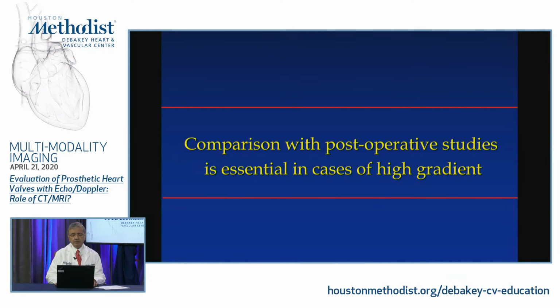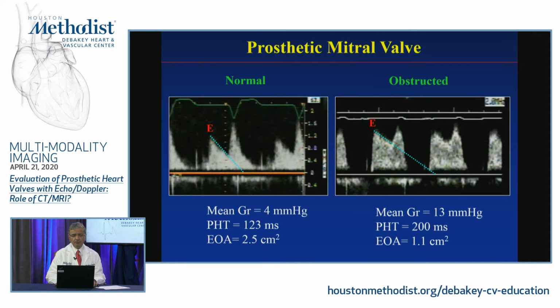A Doppler study is almost like the fingerprint of what that prosthesis velocity, normal gradients, and everything else, all these parameters are in a particular patient. And because there is variability among patients, I think it's great for you to be able to see that. You could do that just before discharge. That's what most people do, although it may not be completely ideal, but you could do that about 2 to 3 months once the hemodynamics are back to normal.